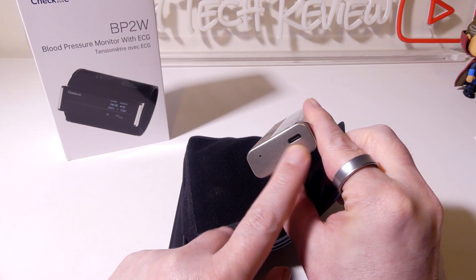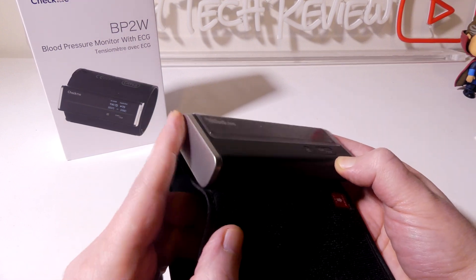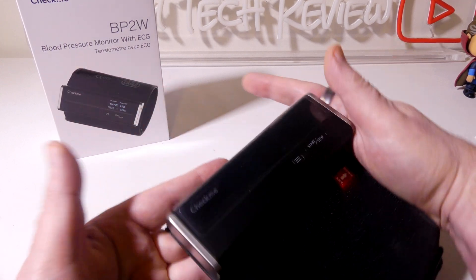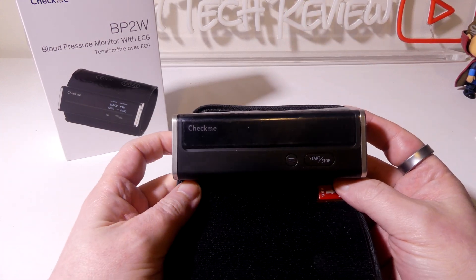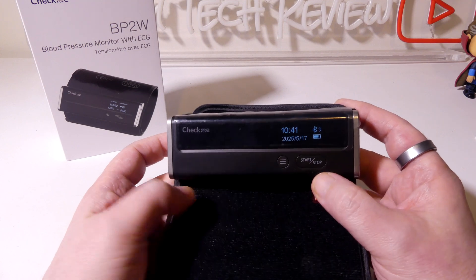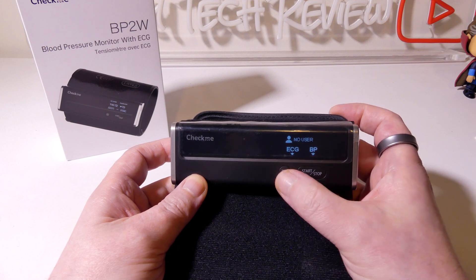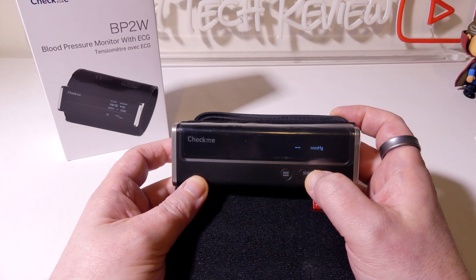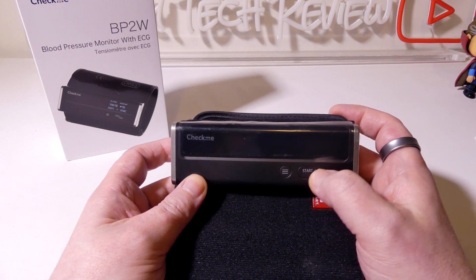As far as connecting this, there's your USB Type-C input for recharging the battery. These two plates are for your ECG — you can do this palm to palm or palm to abdomen for your ECG readings. Pressing the start and stop button shows your battery life, date, and time. Pressing start and stop again will do a blood pressure, and the three-line button will do ECG. Holding the start and stop button will turn off the unit.